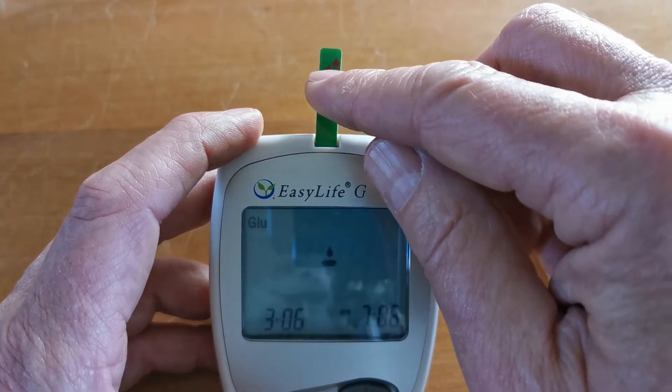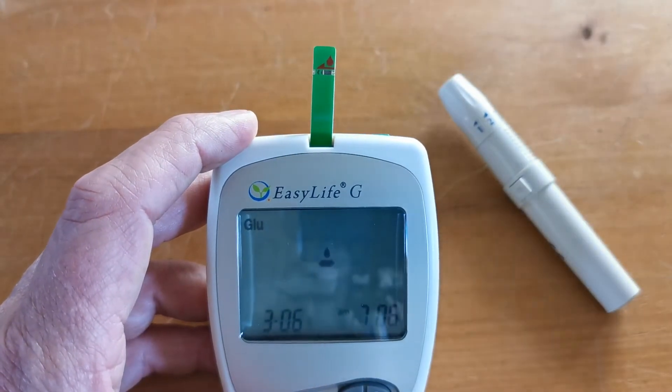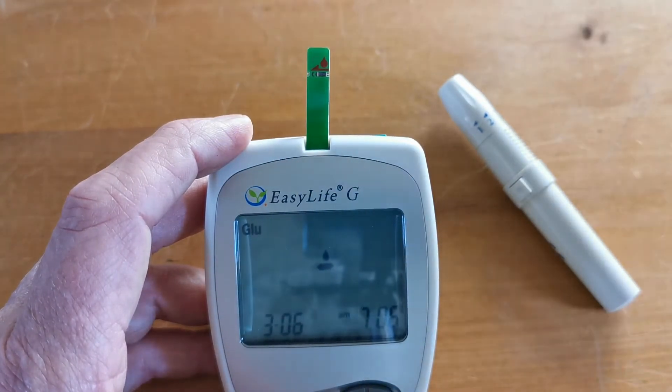You'll see this line in beige going across the test strip with the arrow pointing upwards, indicating the mode or route of transport of the blood, with a blood drop icon just above it.